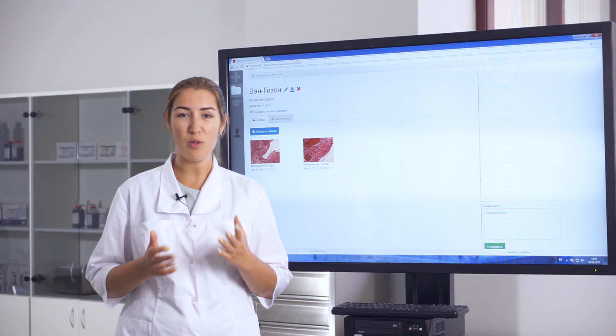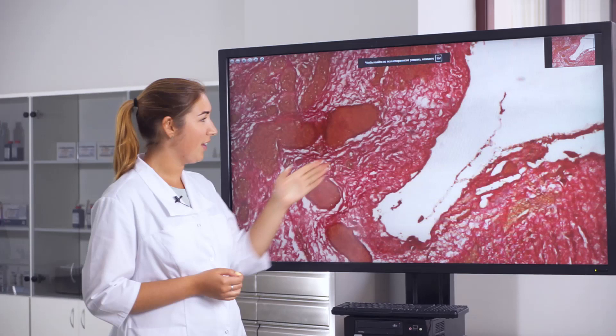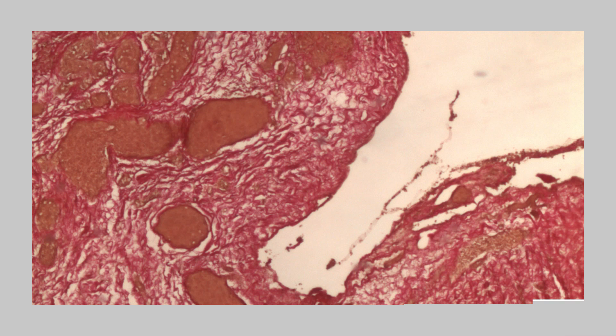To view stained slides, we use the special portal histoscan.com, where you can save and share scanned images. Here we have a sample of lung tissue, and we can see that collagen fibers are stained in red color and nuclei are stained in black color.